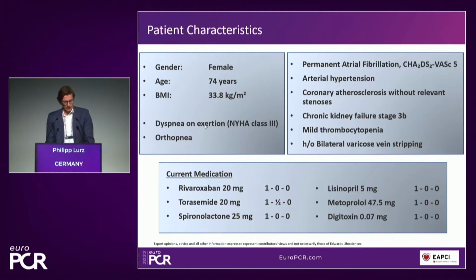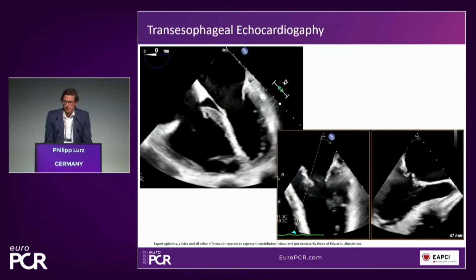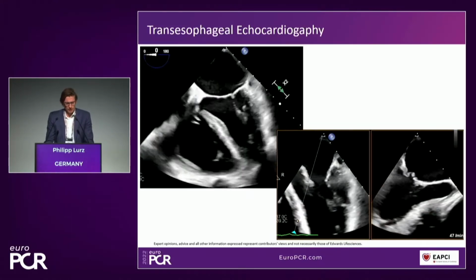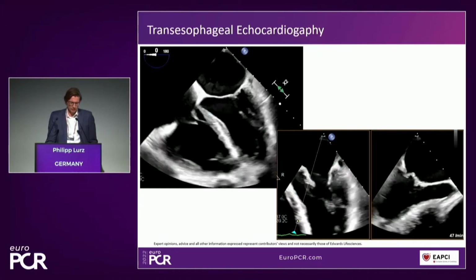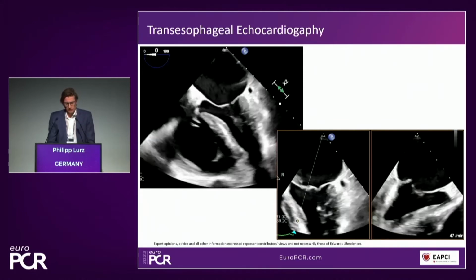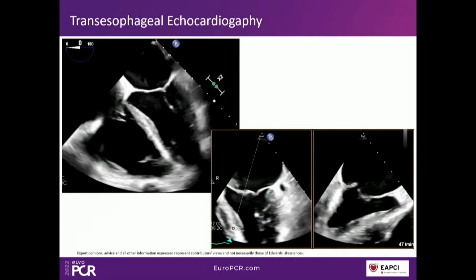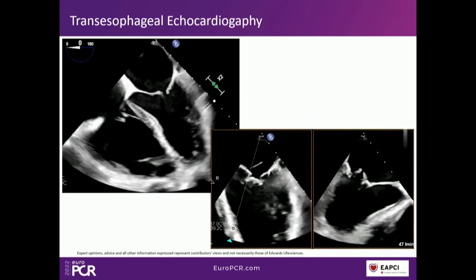Her current medication is summarized here, and you see that it includes already a couple of diuretics. So that's probably the most important slide. You see the echocardiogram of that patient. Left ventricular function is well preserved. Nothing too exciting in the four-chamber view, but then on the right you see the X-plane view, and you can also see on the long axis on the right the pathology.